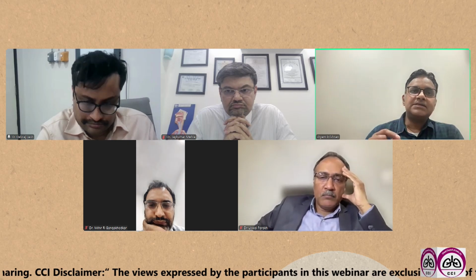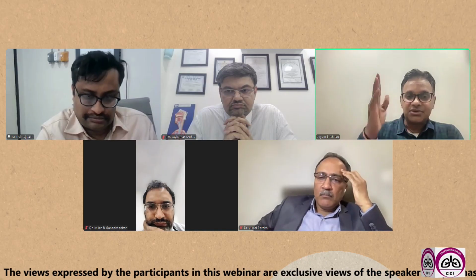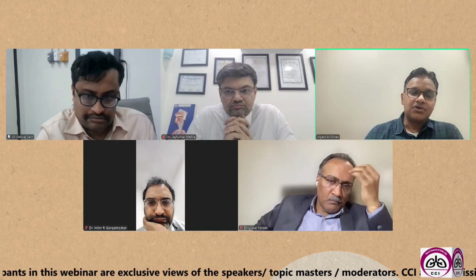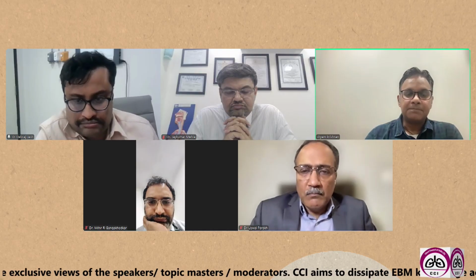The issue with the Olympus needle is just that the sheath is transparent. It's white. So sometimes it's tough to notice the sheath, whether it's out or in, as it retracts back in sometimes when you flex the scope. But now the newer needles which they've got have the colored sheath, because of which you can identify that. And the VisiShot needles of late were very notorious, especially if you tend to reuse them, for causing breakages. They have a spring inside which tends to get dislodged within the node, or if you're lucky, a part jutting out so that you can take it out even if it breaks. So those were the experiences with this.